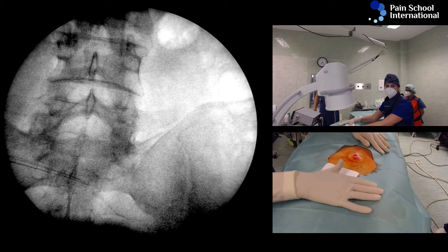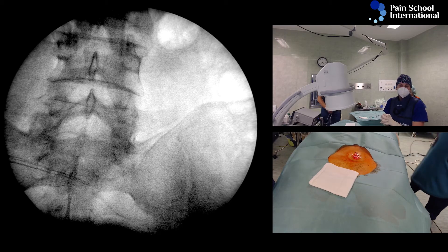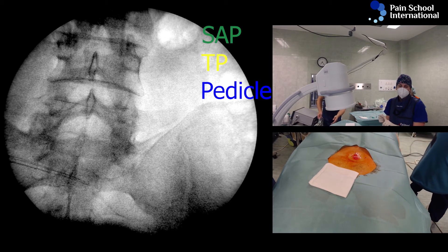We can identify here, easily actually, quite nicely, the L3 pedicle and SAP and transverse process, which is where the L3 medial branch sits.